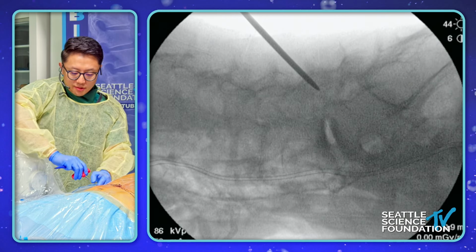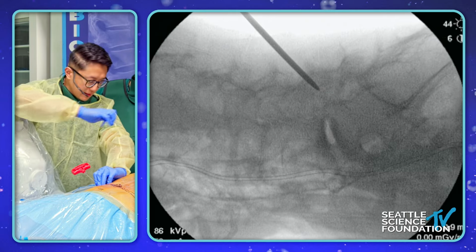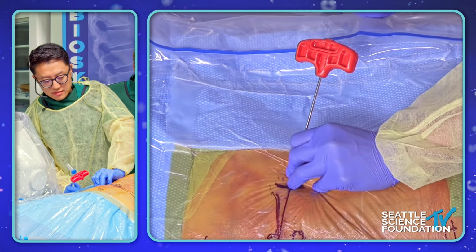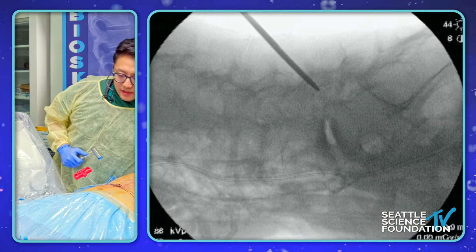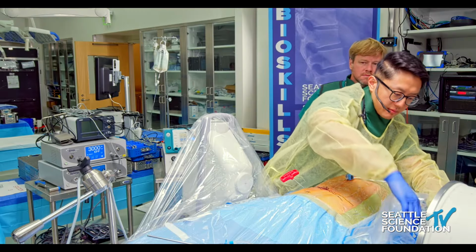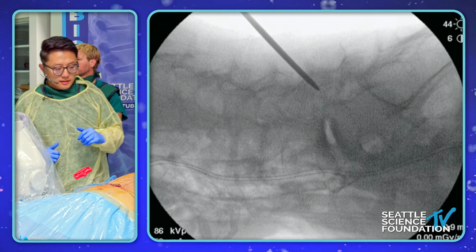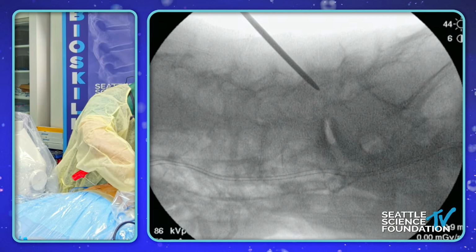So it's really unfortunate that we have such a significant rotation here because you can't really see that I'm docking on the ventral SAP very well on the x-rays. Would there be any way, I mean, it might be too late, to prop up the cadaver a little bit? Yeah, if we could prop this side, that would help, I think. Can we go back to the AP? Yeah, I think we need to rotate this way, towards me. Can we go back to that AP while you prop it up? I think that might help get you a good true lateral.